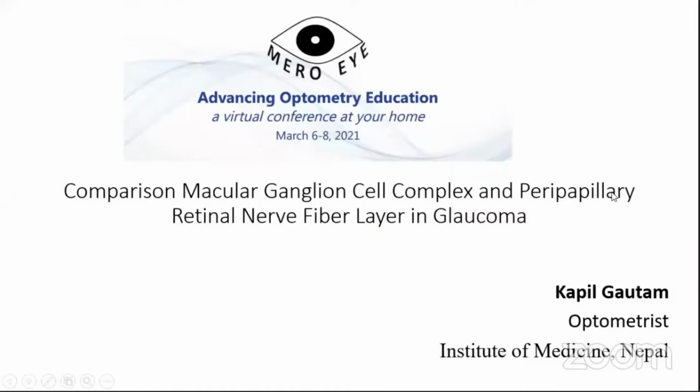Thank you. So my topic for today's presentation is the comparison of the macular ganglion cell complex and the peripapillary retinal nerve fiber layer in glaucoma. I just want to go through a brief introduction first. What do you think if I say glaucoma, or if I say the diagnosis for glaucoma? I think it obviously comes to your mind in two different ways. The first is anterior eye examination, from the slit lamp or other techniques, and another is perimetry, and another is posterior retinal examination, most probably the optic disc.